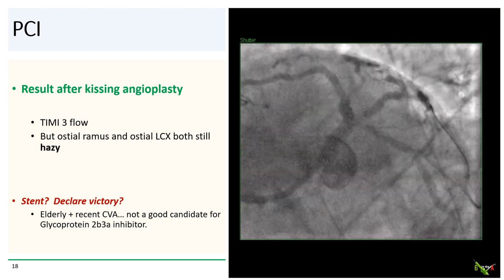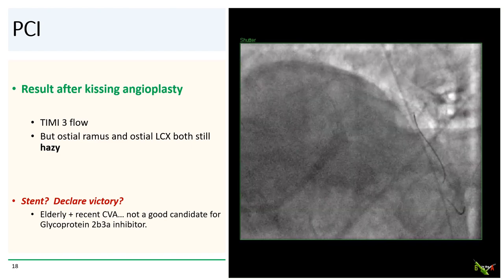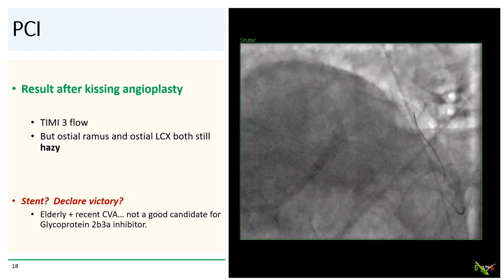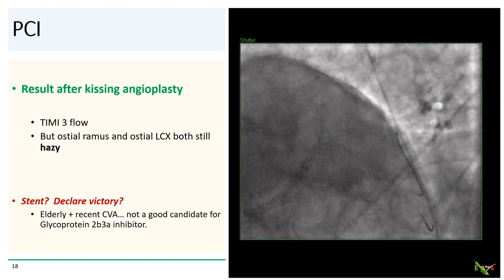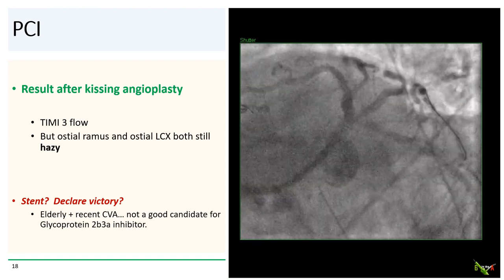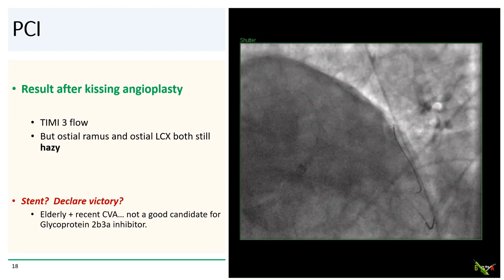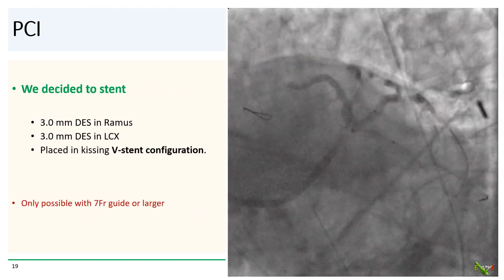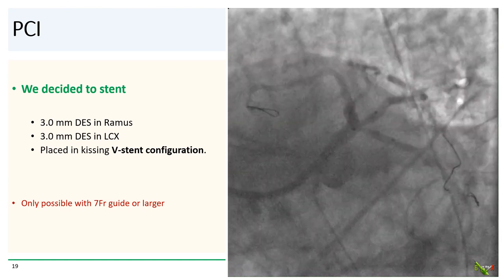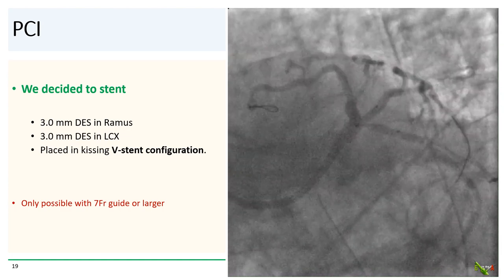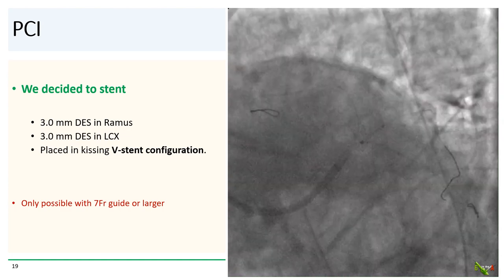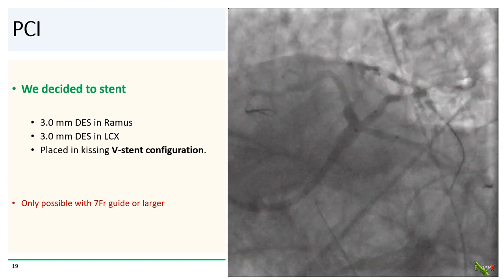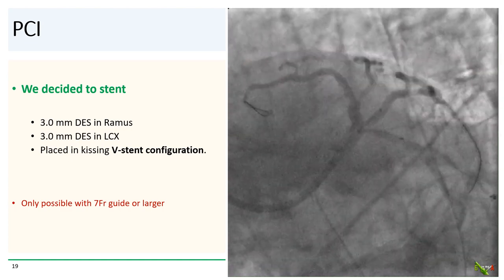So what should we do next? Should we stent, or should we declare victory and walk away? Remember that this is a 90-year-old patient with a recent CVA, so he is not a good candidate for a glycoprotein 2B3A inhibitor. So we decided to stent. We placed a 3.0 millimeter DES in the ramus and a 3.0 millimeter DES in the circumflex in a kissing V-stent configuration.